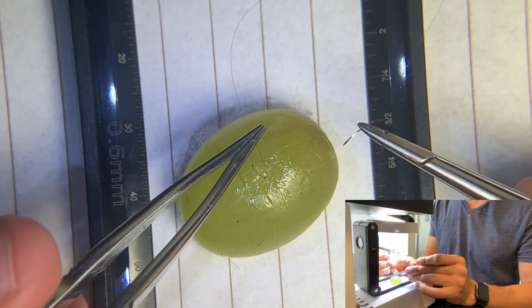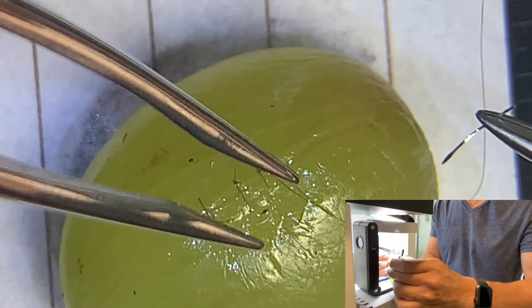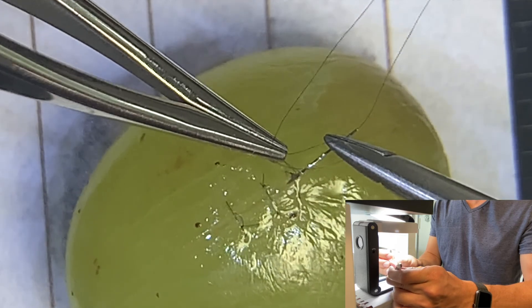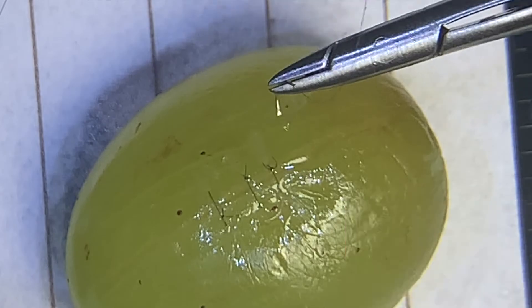If you're really slick, sometimes the sutures will be down like that, almost like an intersection where you can grab two — grab them both at the same time and cut both with one swipe. The point is: have a script. Be able to go through it in your mind's eye without any props, without the instruments and needle. Then get reps in. Do your script over and over. As you do your reps, you'll run into pitfalls — figure out the pitfalls. I'll make some videos on common pitfalls. Have fun. Peace.